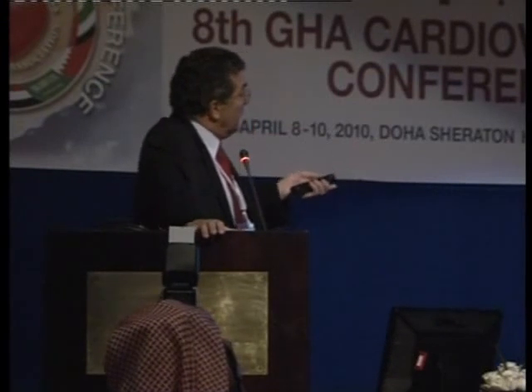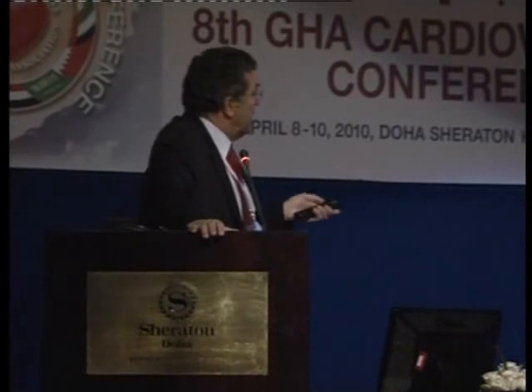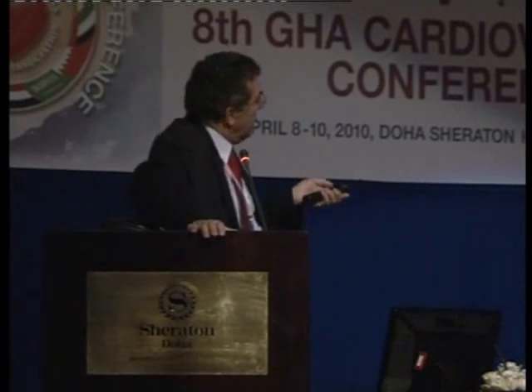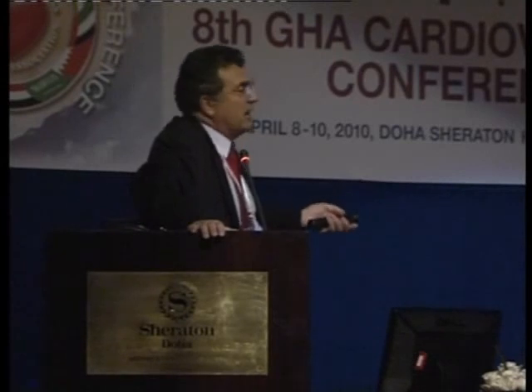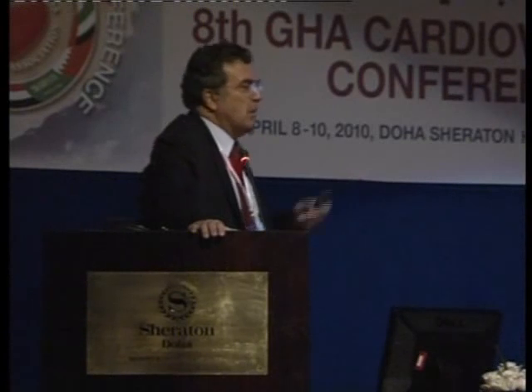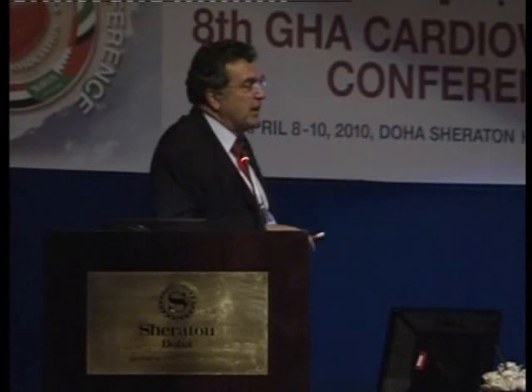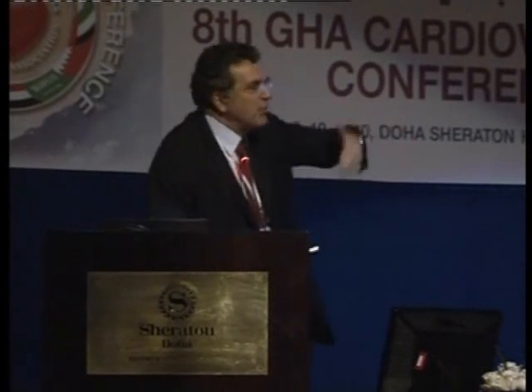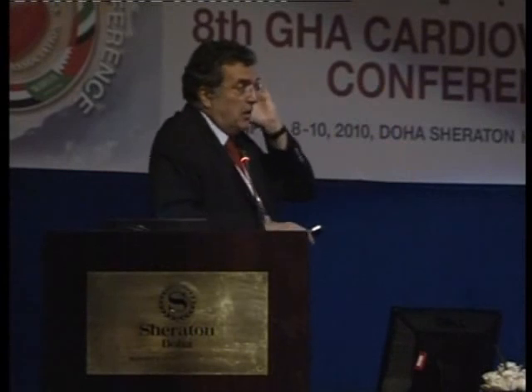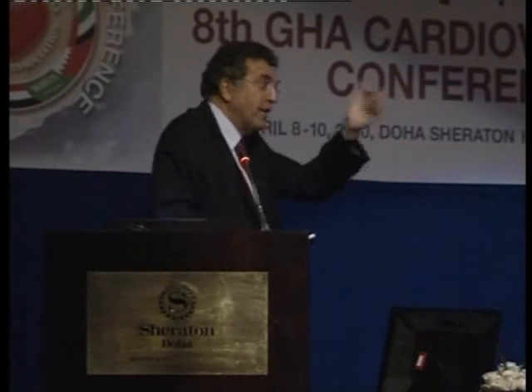But anyway, when you look at this bifurcation, there is no doubt on the LAD. Critical is more than 80% angiographically. But the doubt is on the diagonal. But the diagonal, the problem is, it's a large diagonal. It's a 2.5 millimeter vessel involving a large amount of myocardium. And this is the reason why I will move to the double stent technique. Concerning your question, IVUS or FFR, I think that if we believe FAME, we have to move to the functional assessment.